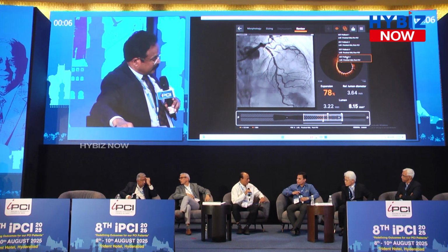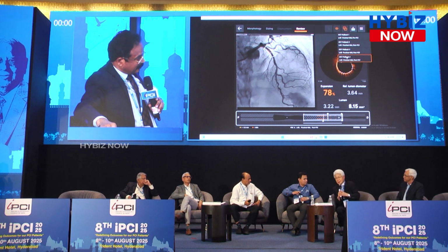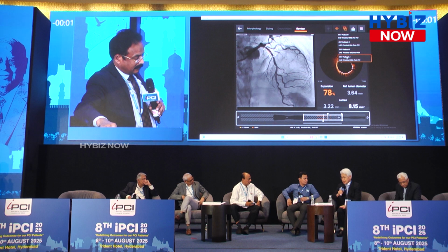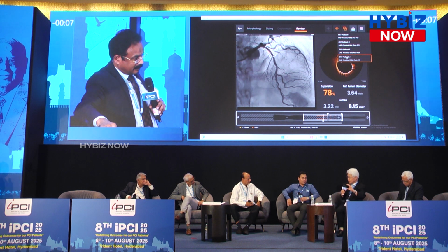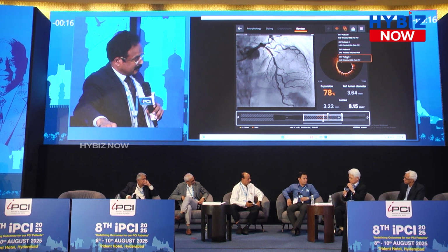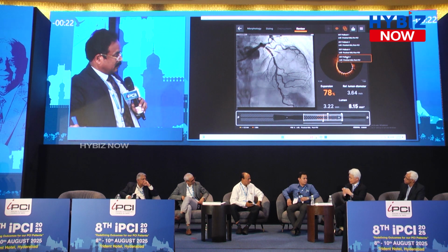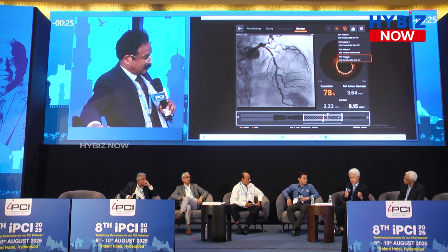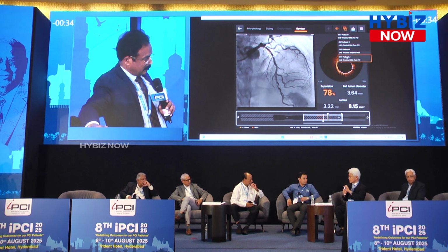What is more important, the area of expansion, the MSA? It depends on the case, but if you treat just on the lumen profile, we sometimes miss the plaque distribution. If there is eccentric calcium plaque, it might be very difficult to dilate more. If you dilate based only on the data of the lumen profile, you may have a rupture of the coronary artery. So at the same time, yes, AI is very important, I agree, and wonderful, but at the same time, we have to check the real image.